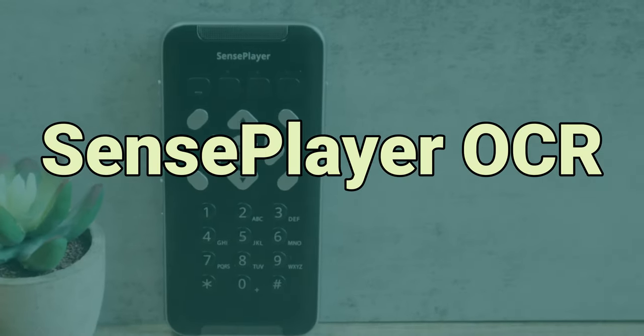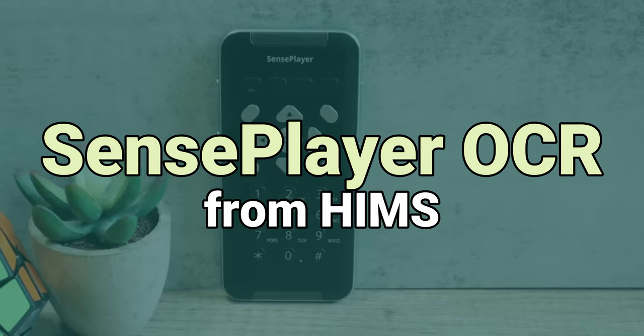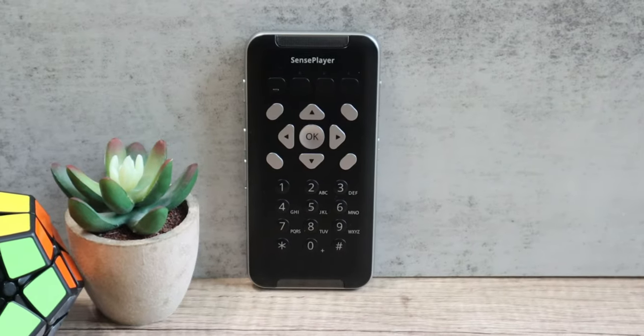The new Sense Player by HIMS is not only a book player, but you can use it to record, read documents, download and listen to podcasts, listen to the radio, control your smartphone, and a lot more. Let's talk about it!